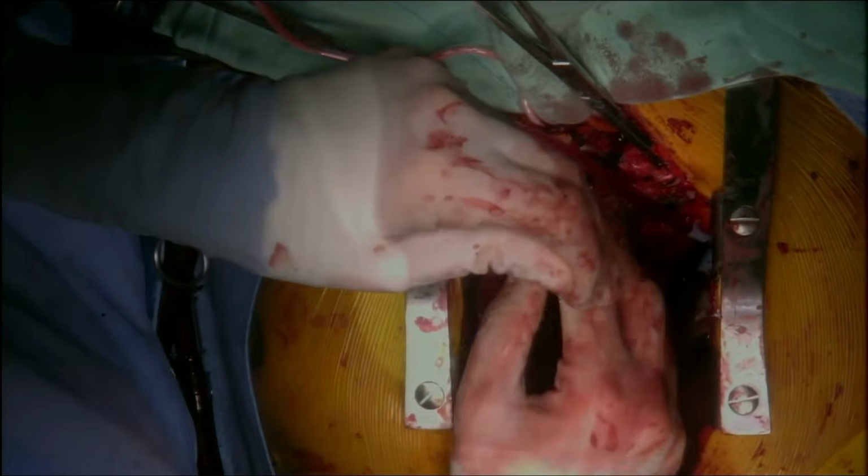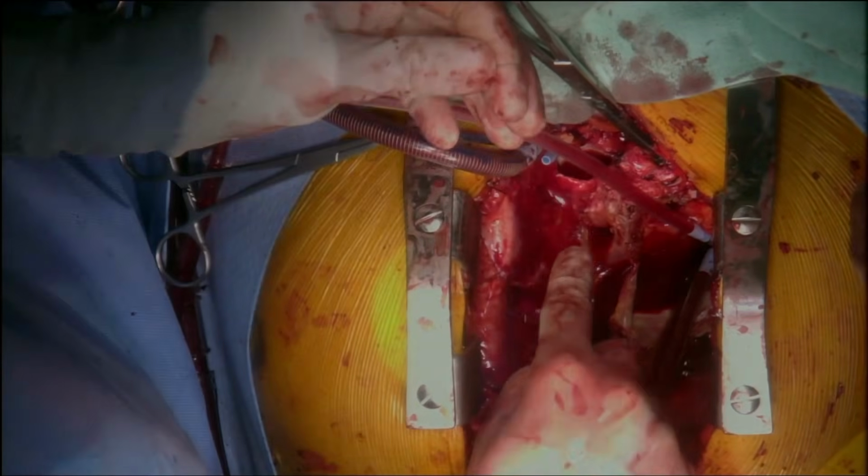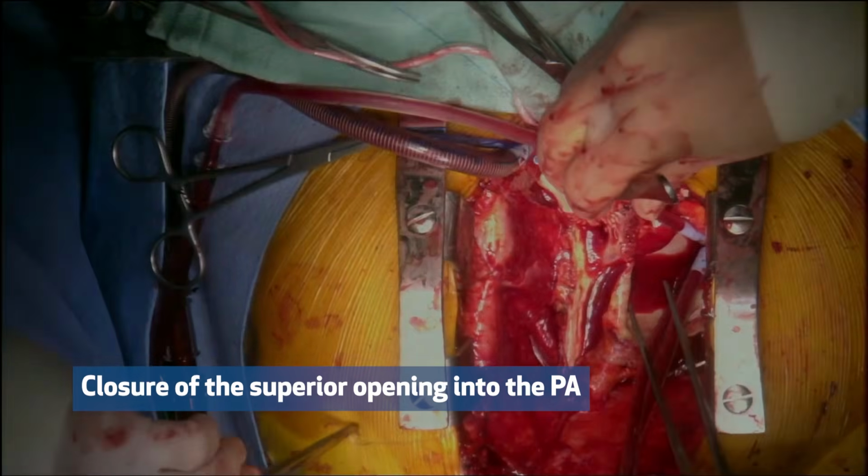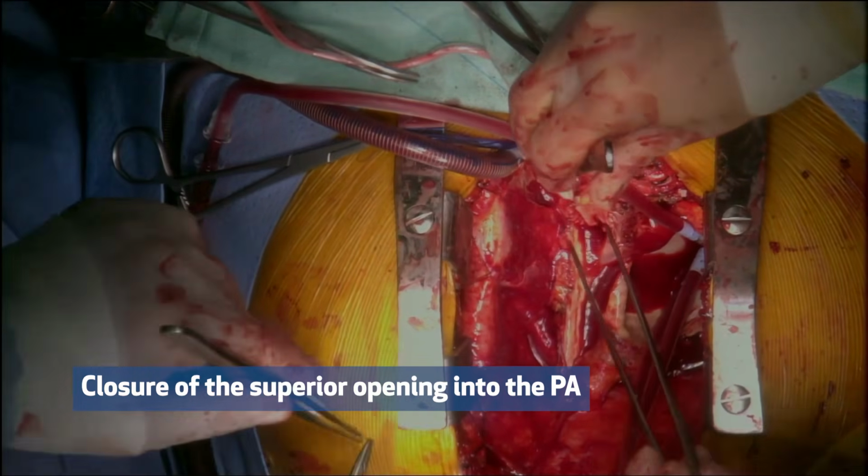The connection between the conduit and the pulmonary artery was closed with the heterologous pericardium, as well as the connection between the SVC and the pulmonary artery.